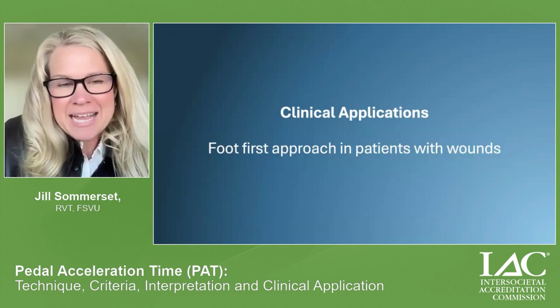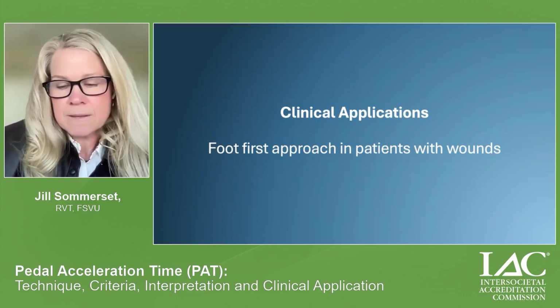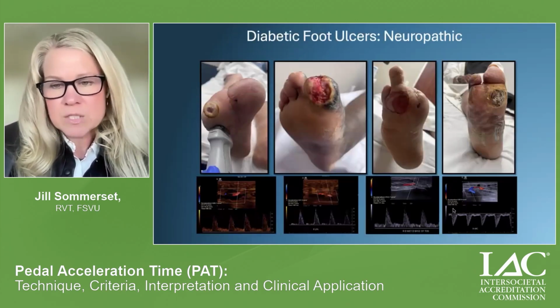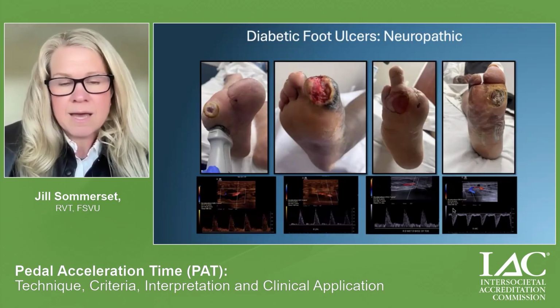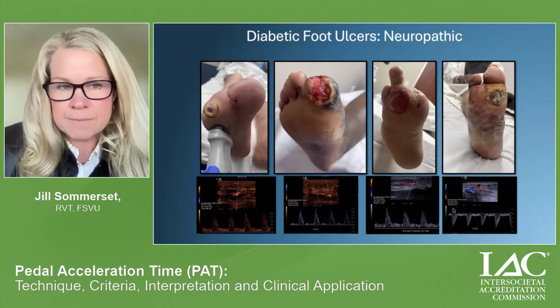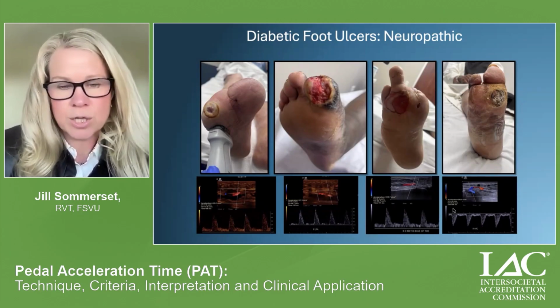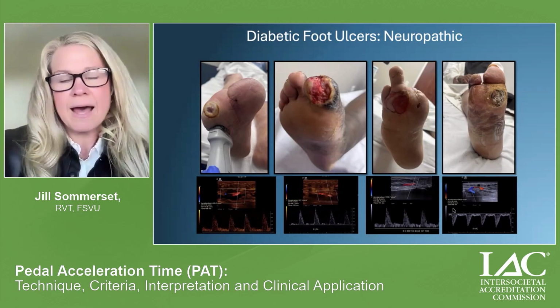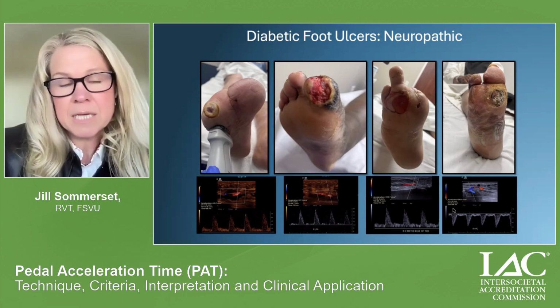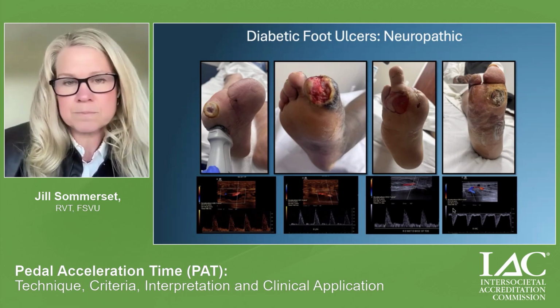So let's talk about the clinical application of PAT. And really, this is a foot first approach in patients with wounds. And you can see here that these patients are really challenging. Their ABIs are non-compressible. We don't have digits to do a proper toe pressure. Maybe we can get a waveform on maybe that large toe, but all of these patients have class 1 PAT, meaning that these are neuropathic diabetic foot wounds.